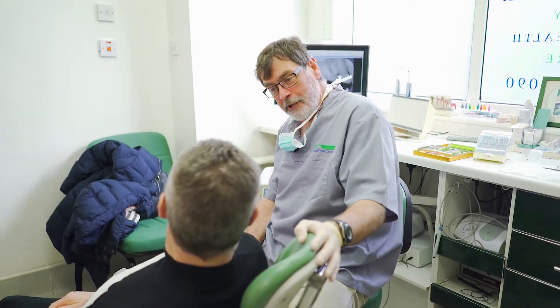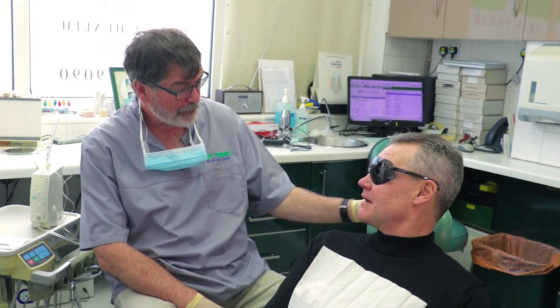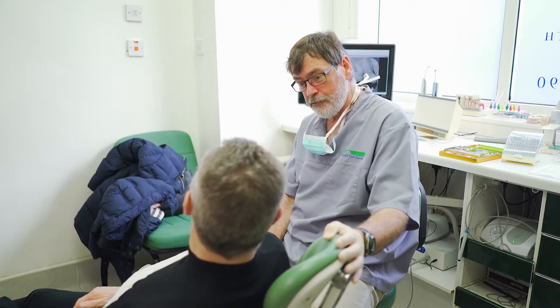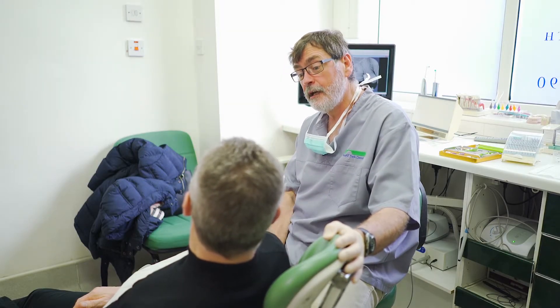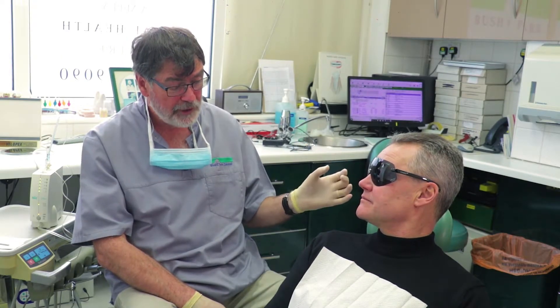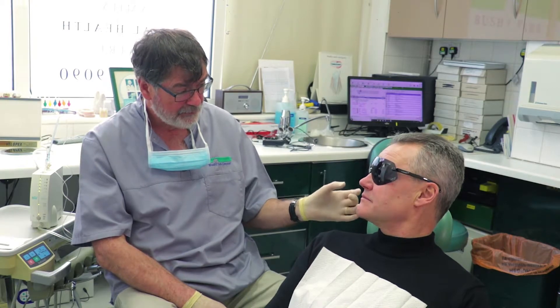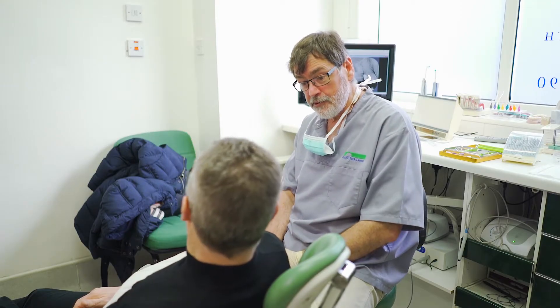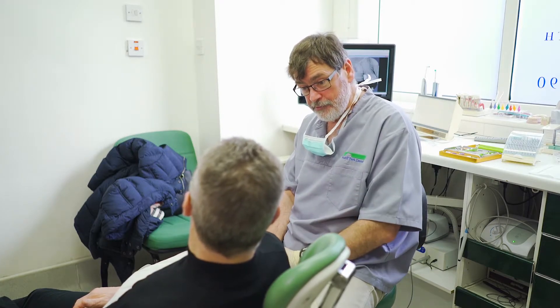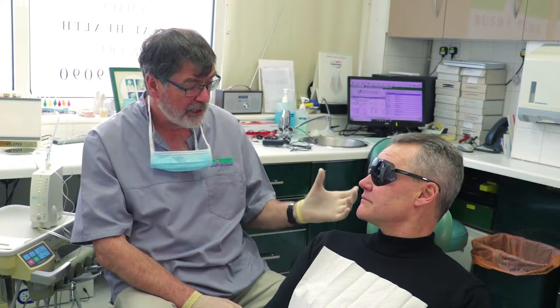The purpose of this is to show you how we're going to numb him up to carry out this procedure. So I understand you've lost a couple of crowns — up on the top right-hand side. We've looked at your x-rays and decided to put a new crown on the sixth tooth and redo the onlay that has come away from the number seven tooth. They were both put in about 20 to 25 years ago, worn down quite a bit, edges aren't really good. So renewing them is probably the best thing to do.